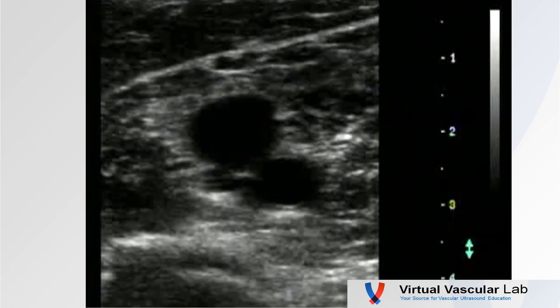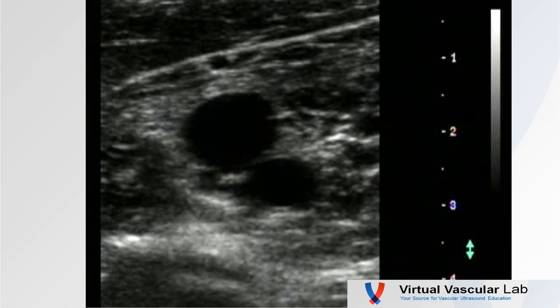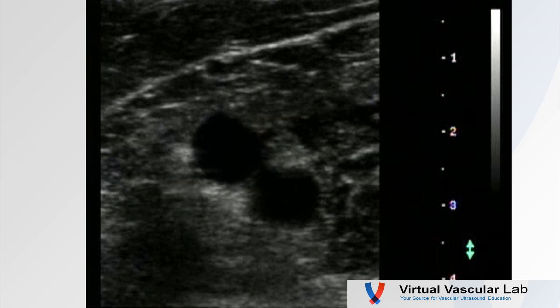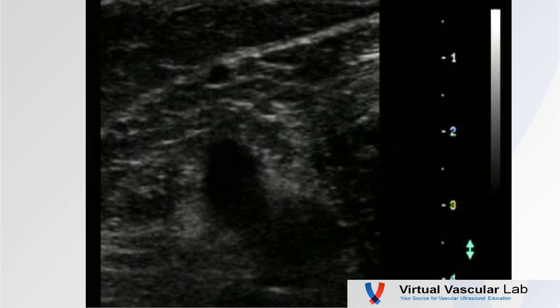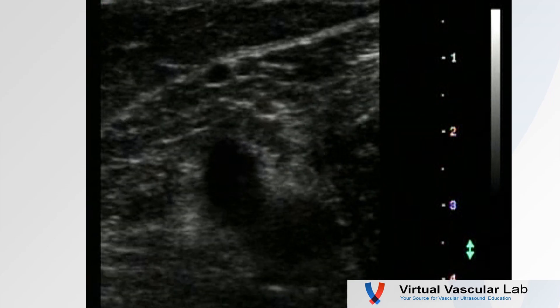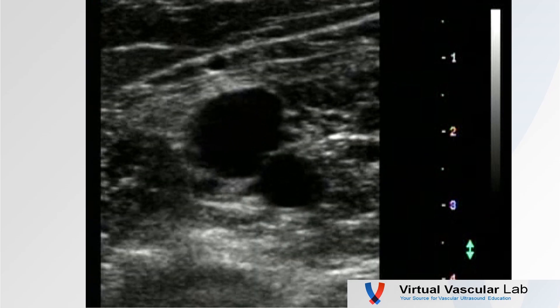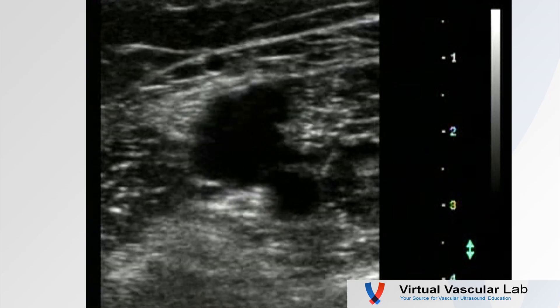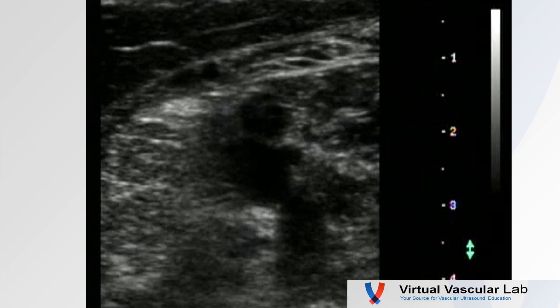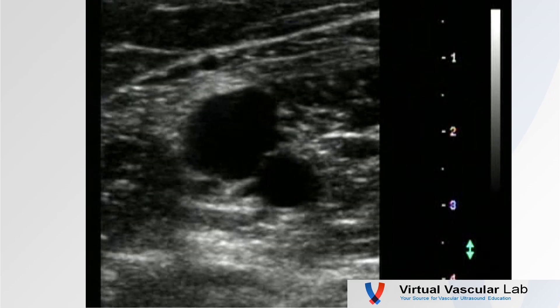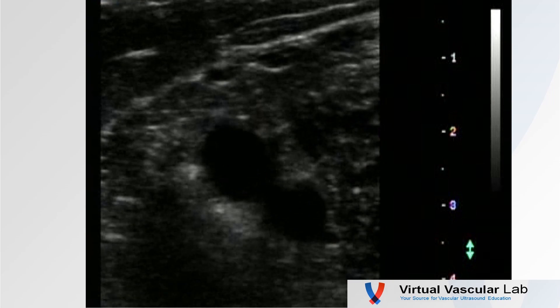You also need to consider angle of incidence in a transverse view. Here's a nice view of a popliteal vein and artery — a very crisp picture when I'm at 90 degrees. However, when I angle off, you see it's not so crisp. Back to 90 degrees, then angle off again. Always be cognizant of that angle of incidence, even in transverse view.